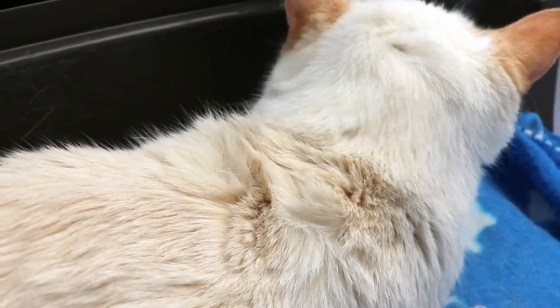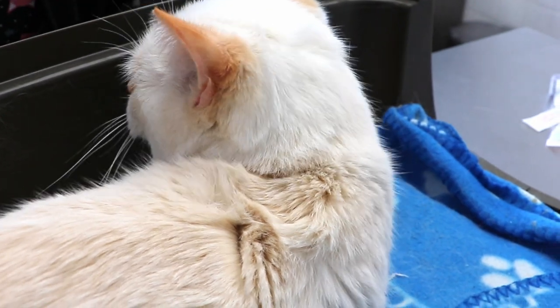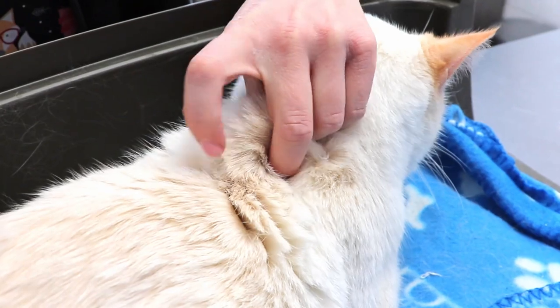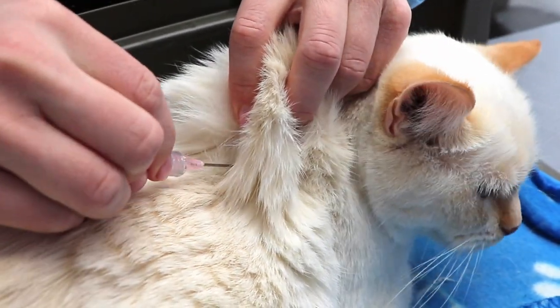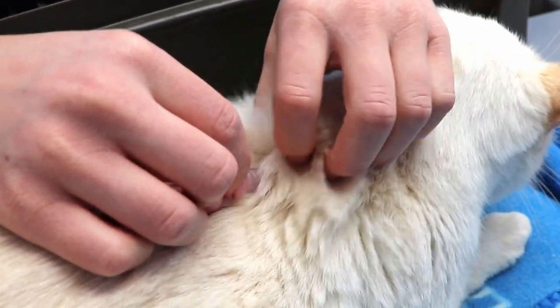So I don't know if you want to give it a try or if you want me to show you first. Probably best to show me first. Okay. Because I have to admit it's my wife that actually did that more than I did. Okay. Yeah, so we just pinch like that and then just go right in there. Oh, I'm sorry. It's okay buddy.